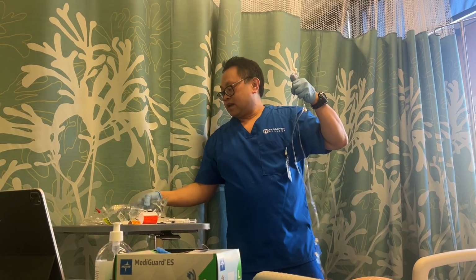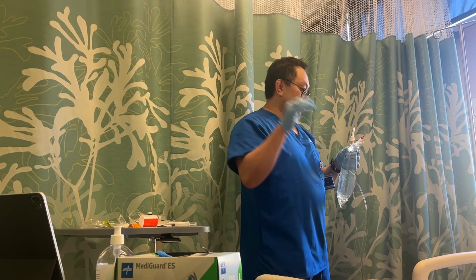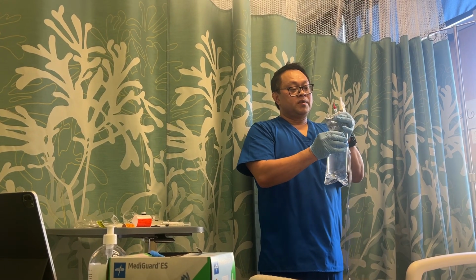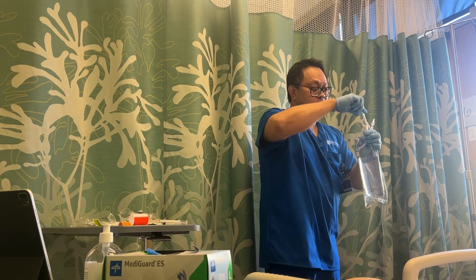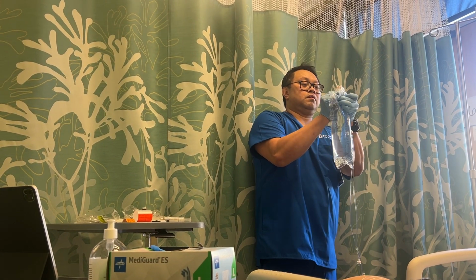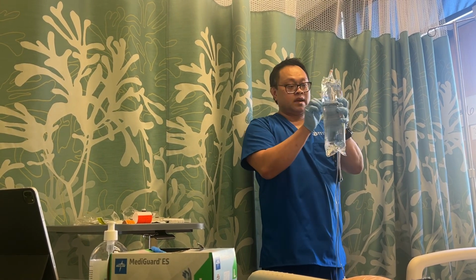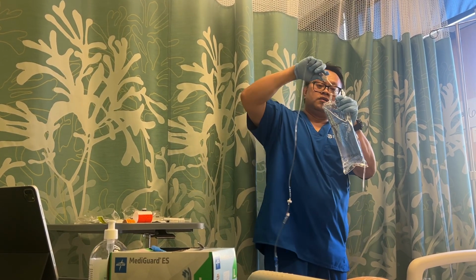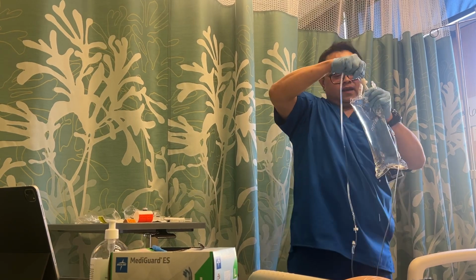Okay, so now again, I check the medication clarity, expiration date for all 3, which is the most important thing. Now I'm going to properly open this and spike it without contaminating the port. Right there. So without contaminating the port, okay? Okay, so there we go. All right, it is in.